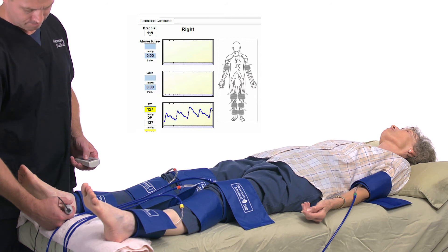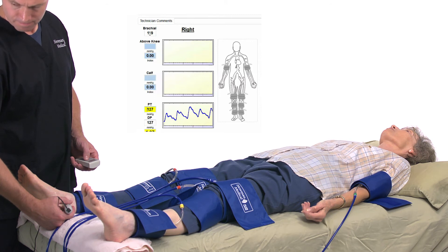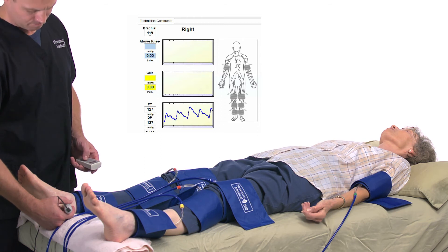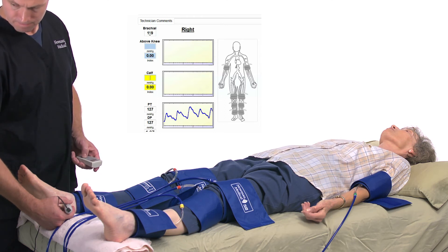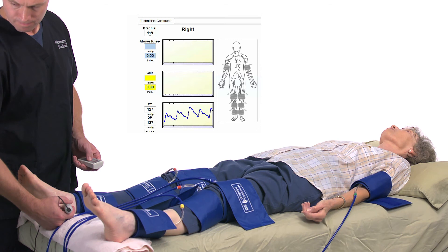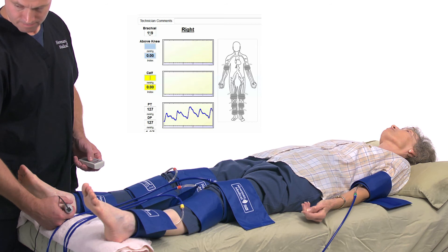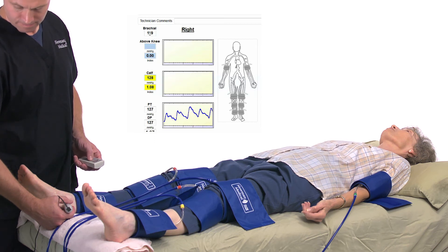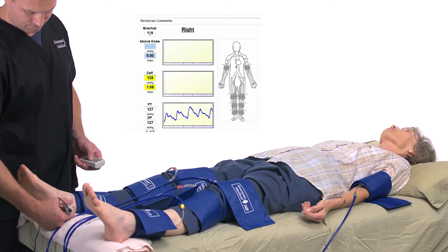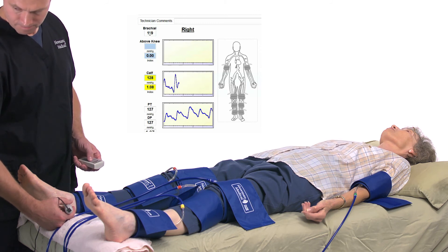The patient should remain still during the measurement. You can repeat the measurement by pressing the waveform button again. When satisfied, press Next to move to the right calf. The system will move to the calf location. Remember that the pressure depends on the cuff location, not the probe, so keep the probe on the ankle. You can use either the PT or the DP, whichever you found easier to find and maintain. Press and hold Inflate to occlusion, then press Pressure when blood flow returns. Press Dump to prepare to take a waveform, press the waveform button, and wait a few seconds for the PVR waveform to appear.